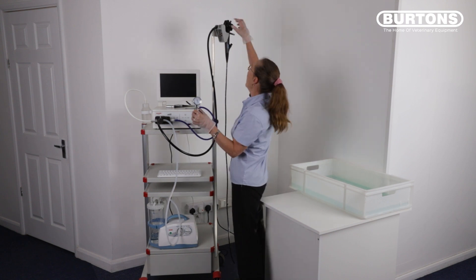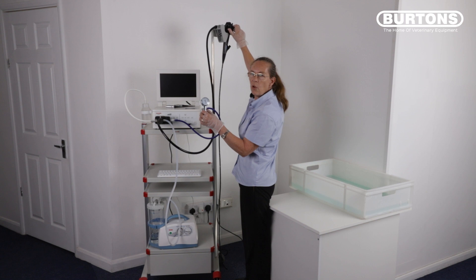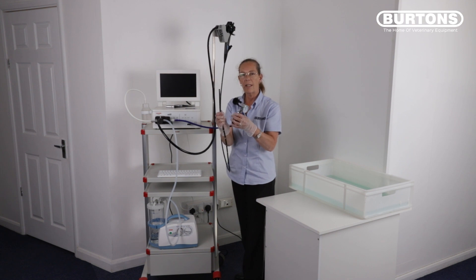With the leak tester attached, move the scope wheels all the way forwards, all the way backwards, all the way to the left and all the way to the right. This will ensure that you're not masking any small holes or perforations down at the distal end of the scope, and the needle should hold steady.